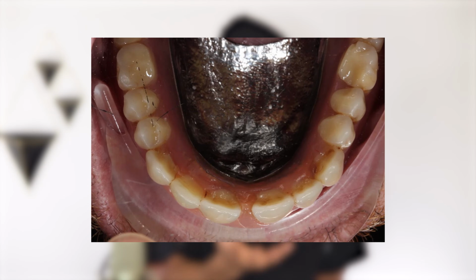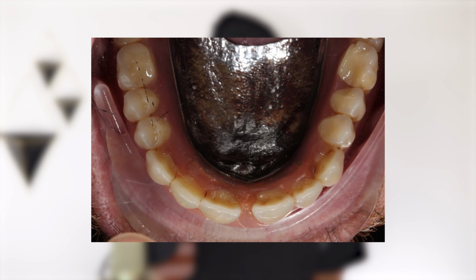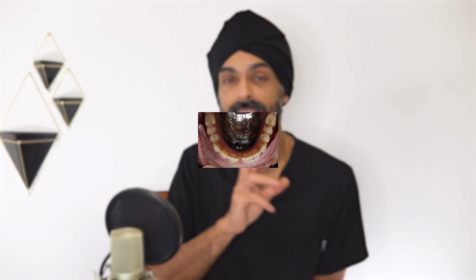Now, you can have metal in a removable denture. I don't have loads of experience, but there are two patients who I can think of where we have done this, and they absolutely loved their denture. It does add a little bit of weight, but if the suction is good, the extra weight doesn't really matter.